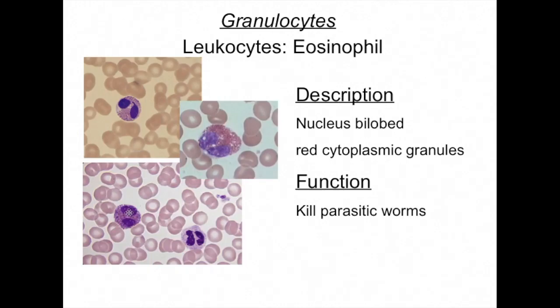On these slides, you can see what the variations of an eosinophil look like. Some could be a little bit spread apart, they could be connected, but essentially they all have 2 lobes and a very dark red granulated cytoplasm.